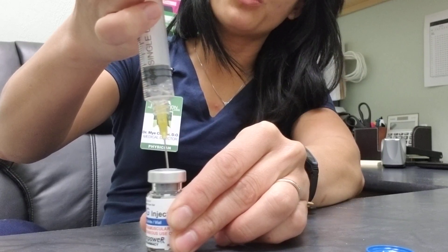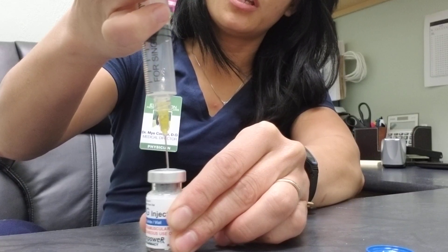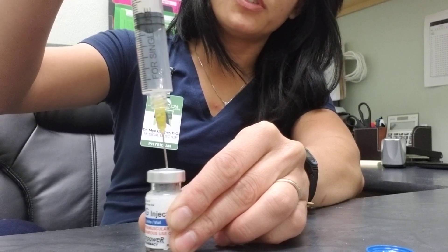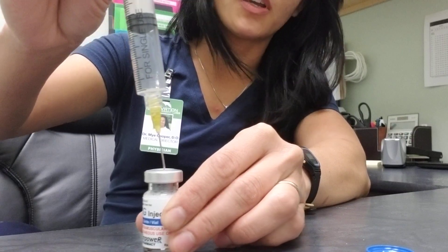Pull the needle up to press in more of the solution, and then you're going to get a return of 6 cc of air. This is to equalize the pressure inside the vial.